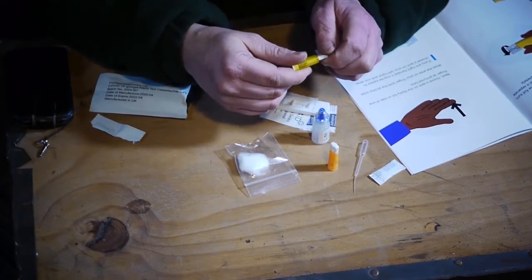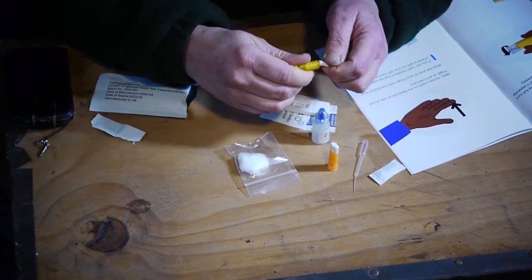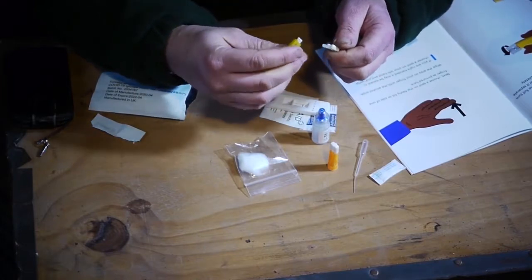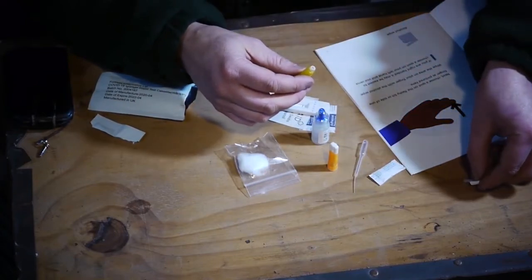Twist the cap. So, yeah. Have I done this right? Oh, there we go, that's separated from the... Yep, so that's the cap off.